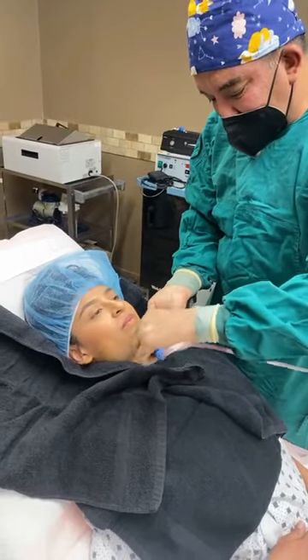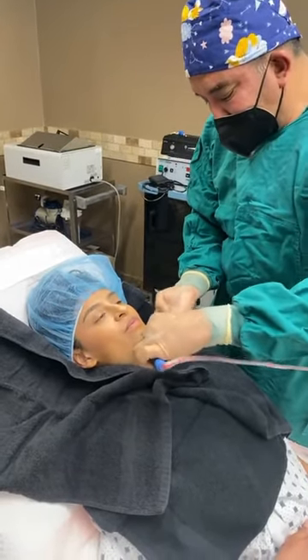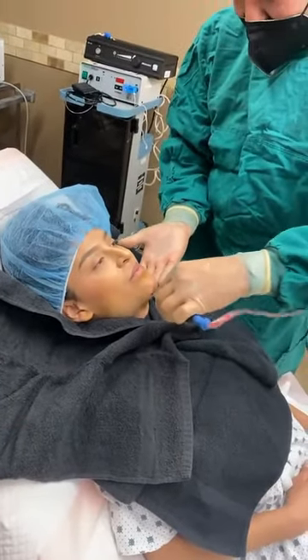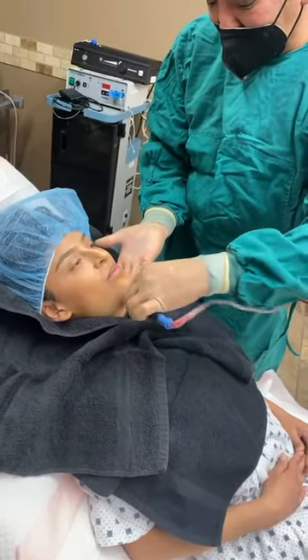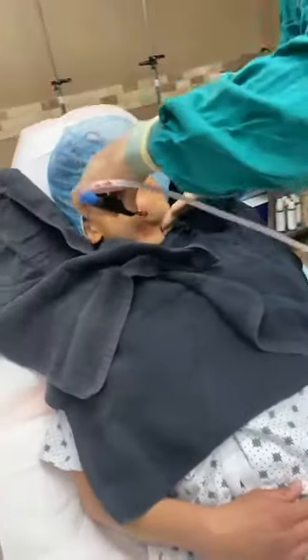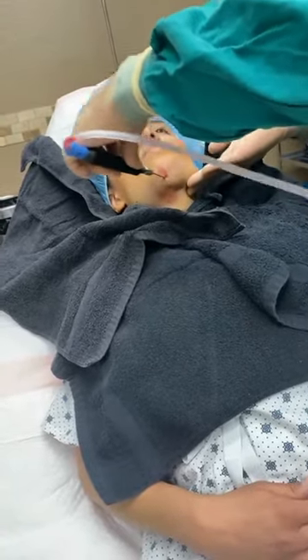And again, I can do this with hand cannulas, but I always break the suction because I do it from so many angles. And again, very superficial, and you have to be careful not to damage the skin because you can leave a mark or an indentation. So this is very, like, two fingers only. That's how I'm inserting, two fingers with my hand underneath and two fingers I'm holding the cannula. You can't force this.